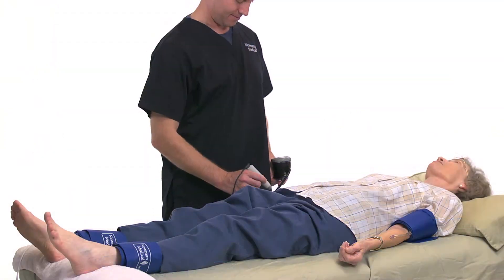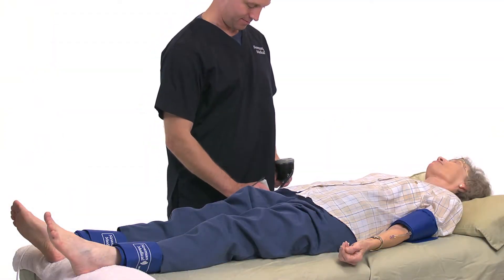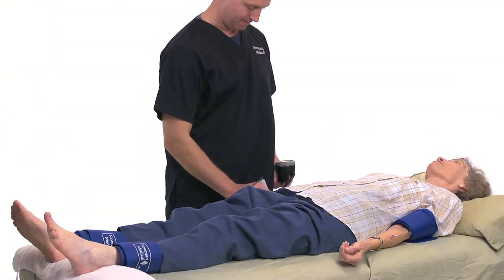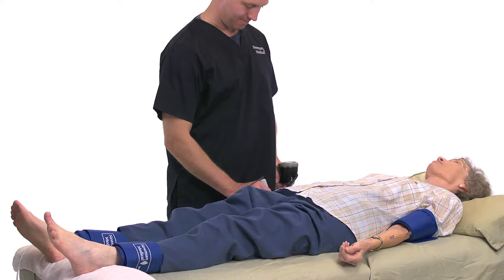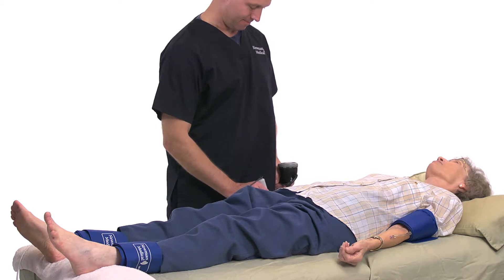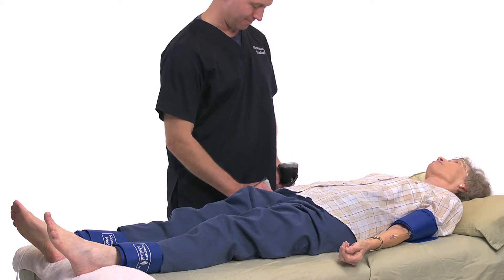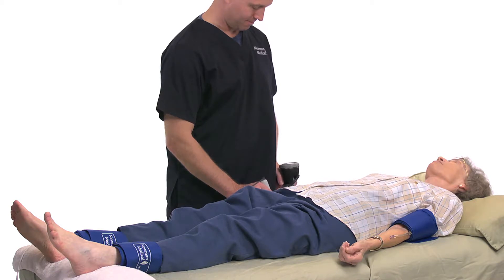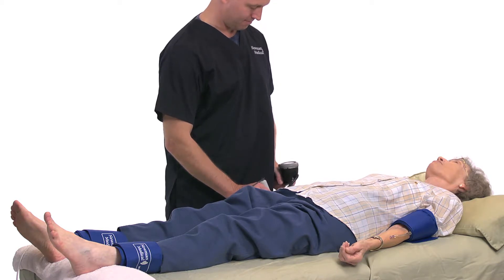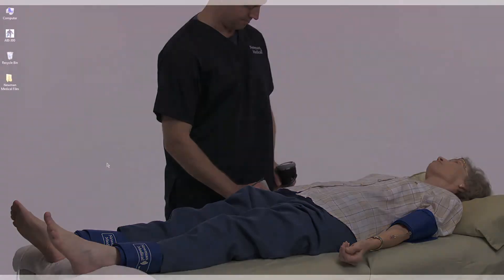Have the patient lie down in the supine position, relaxed with their head and heels supported in a comfortably warm room. Wrap appropriate-sized cuffs, usually 12 cm on the arms and 10 cm on the ankles, as explained in the section on cuff wrapping.